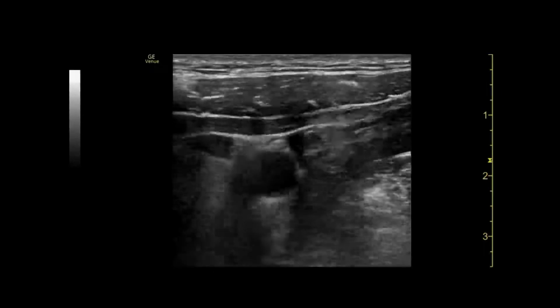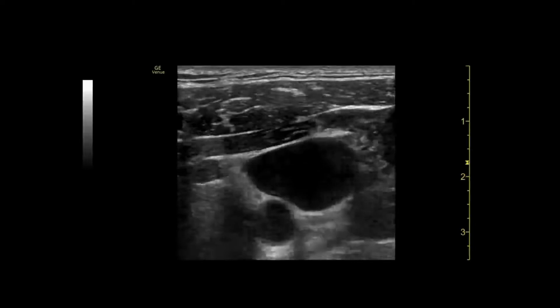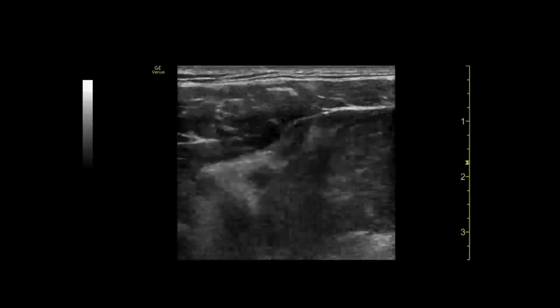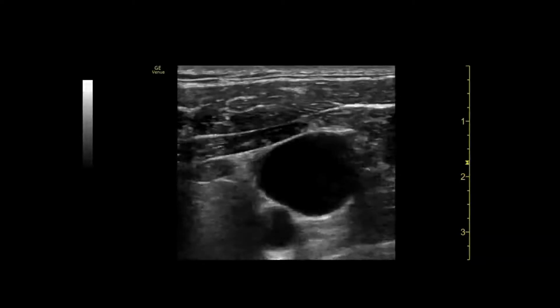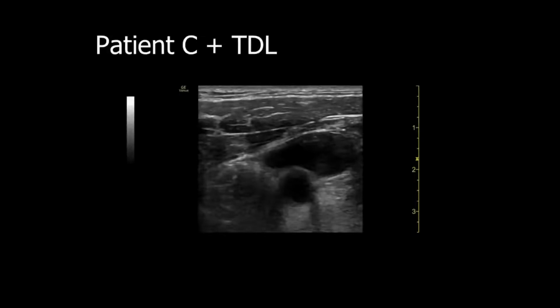So this is important. This patient actually was just laying flat, so it's a low central venous pressure. We asked the patient to do a Valsalva now, and you see really the real size of the vein. That's important. Sometimes when you're putting a line, the vein looks very small. You can actually ask the patient to do a Valsalva, hold it for a second as you have the needle very close to it, and then you take a moment and just puncture the vein, put the wire in. If the patient is able to hold breath for 15, 20 seconds.